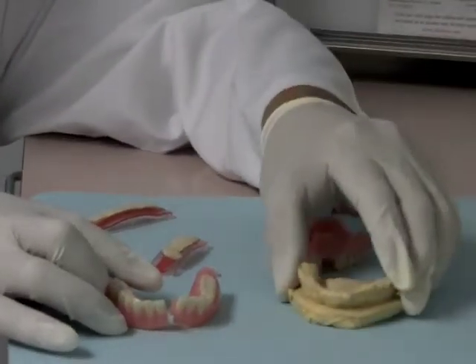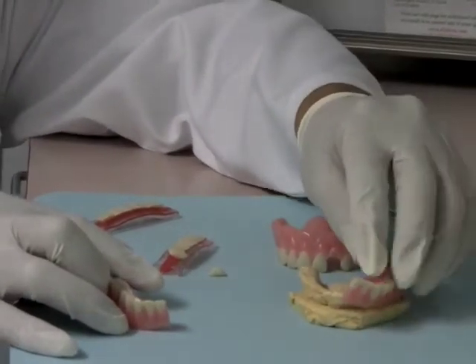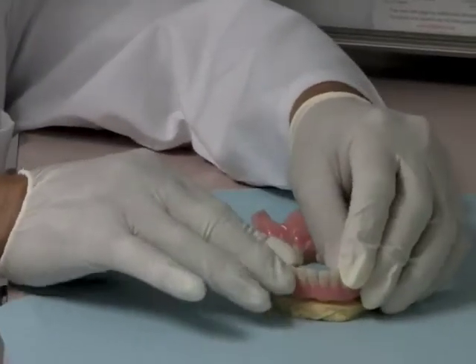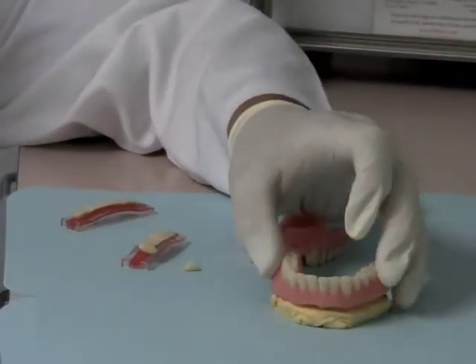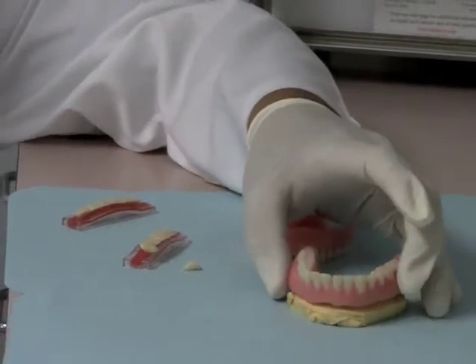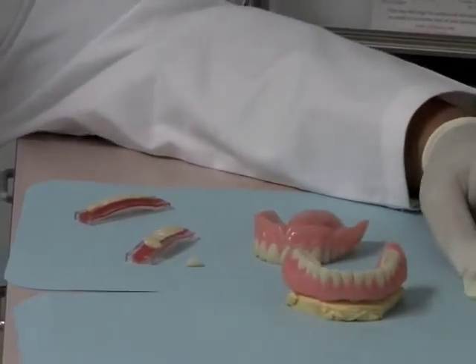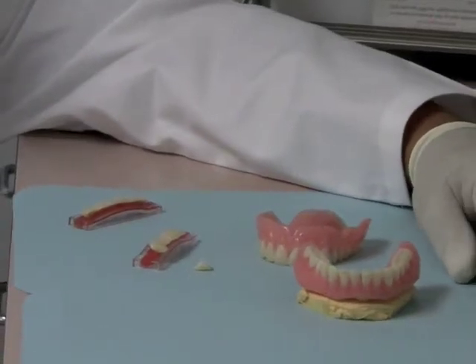This is actually something that I made to help repair a denture, and this would be the type of model that we would have to make in the lab to repair the denture. So I'm going to show you how I do it here at the office. If I have time, I'll do my own repairs.